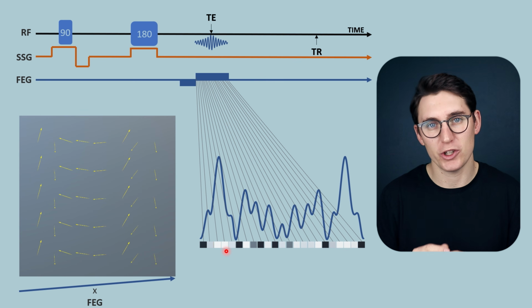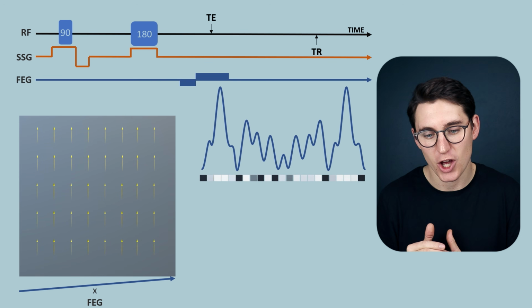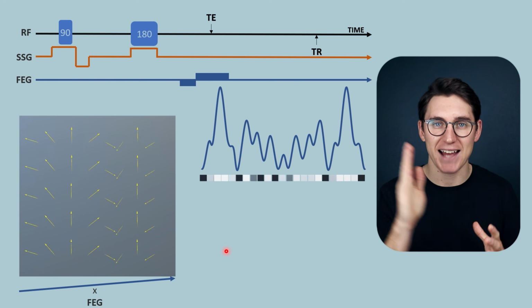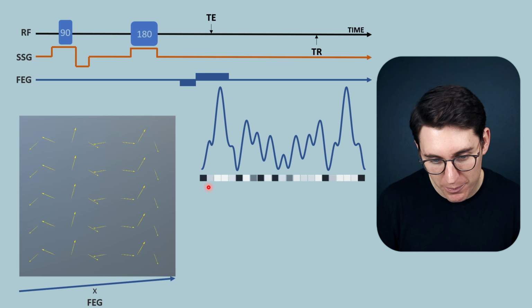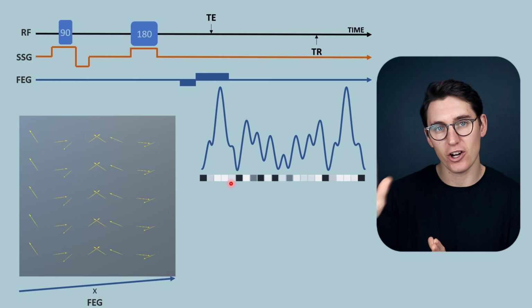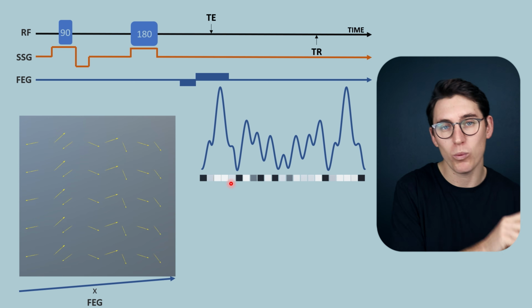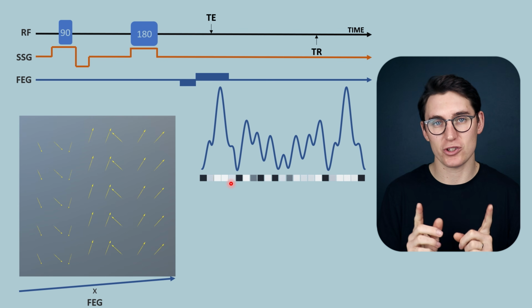Essentially what we're doing here is creating multiple simultaneous equations where we have the answers to what the net magnetization vector is at a given period of time. Each one of these data values represents the net magnetization vector at a given period of time in our pulse sequence. So we've got the answers to what the accumulation of all those magnetization vectors will give us at a period of time. Now we've got two variables that we're trying to solve for here.